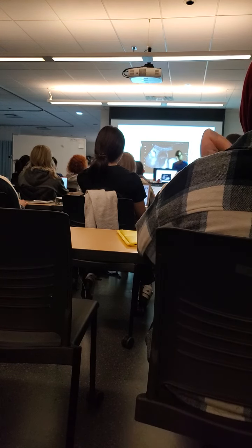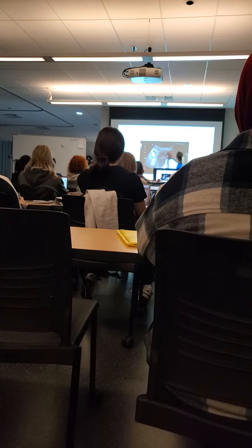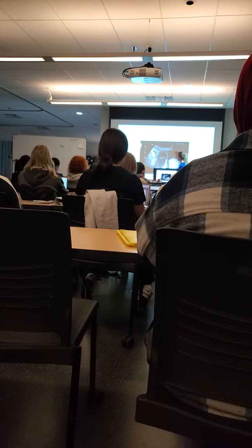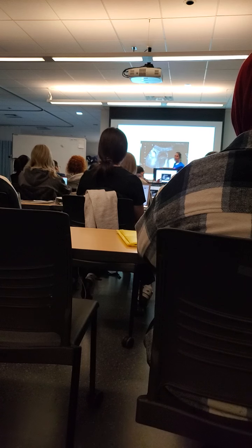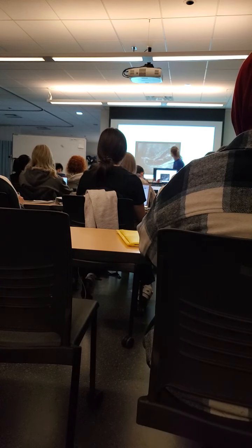So this is our gallbladder right in here. We've got a little bit of fluid around this. I don't know if this is in ascites patients as well. But we're starting to see our wall is starting to fall apart. So this should be in the fundus, and it's kind of falling down.